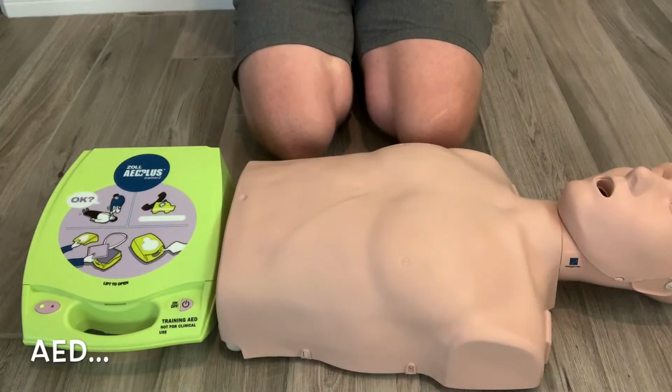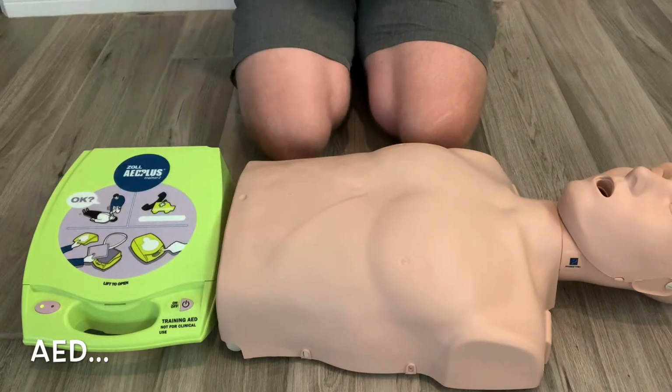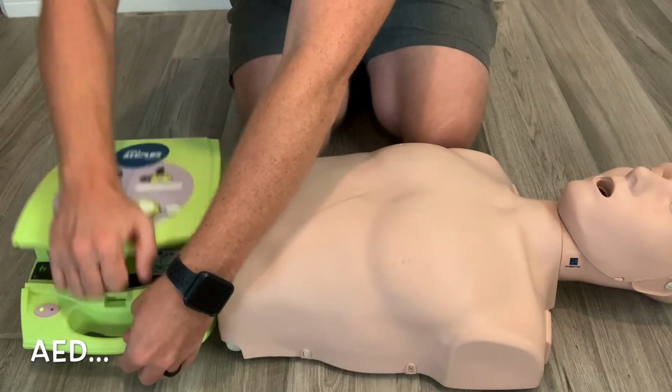Right now we're going to go over the use of an automated external defibrillator, or AED. There's only 3 steps to this, and it is turn on the AED, open it up, and follow the AED prompts.